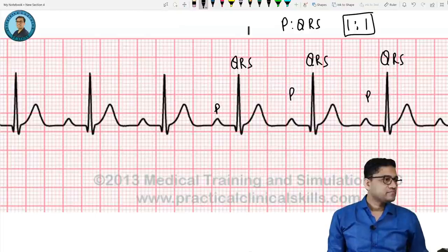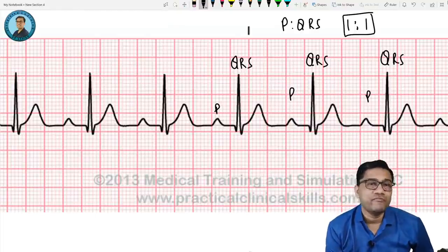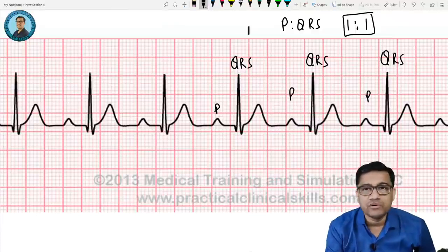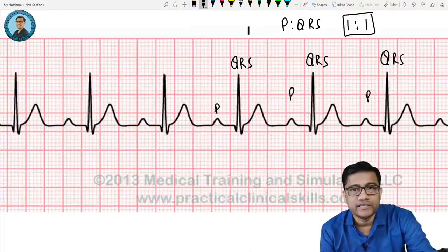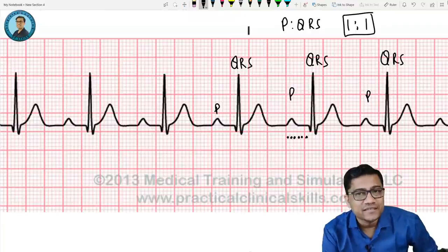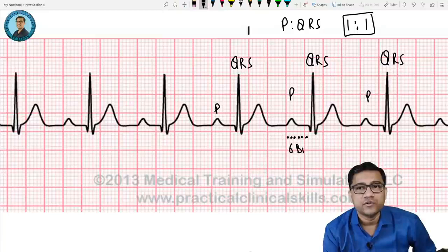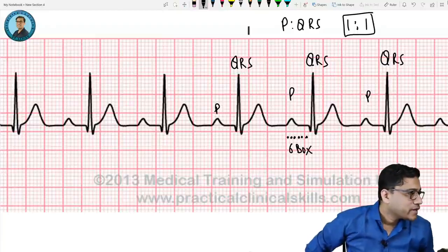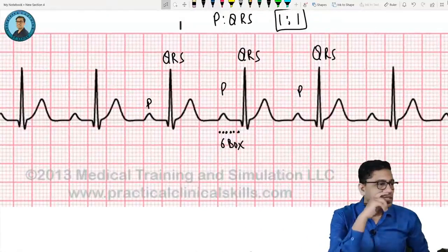Perfect. Okay. So now let's count the number of boxes. Can we count? See, one box. I'll write like this. How many boxes? One box, two box, three box, four, five, six. There are how many boxes? Six boxes. Just see here, clear? Aisha Samad, please see this, okay? That was not a good ECG. Look at this. So can you see six boxes?